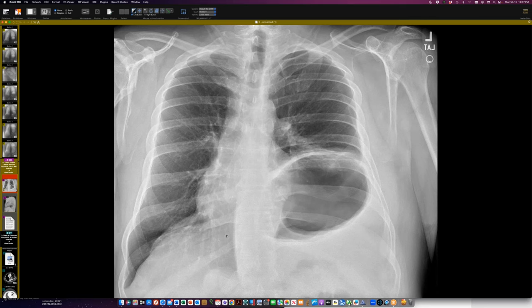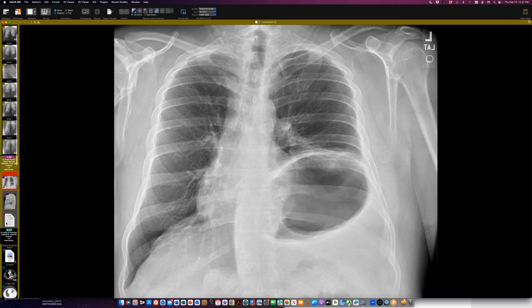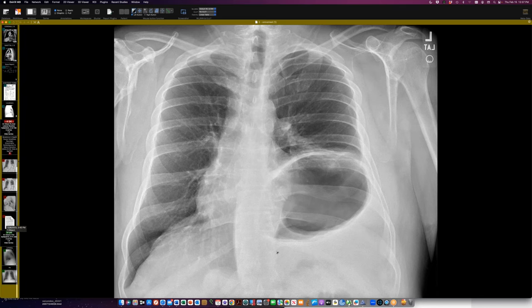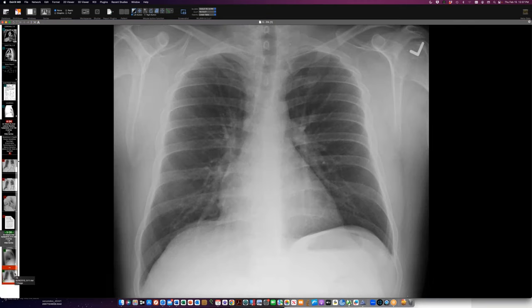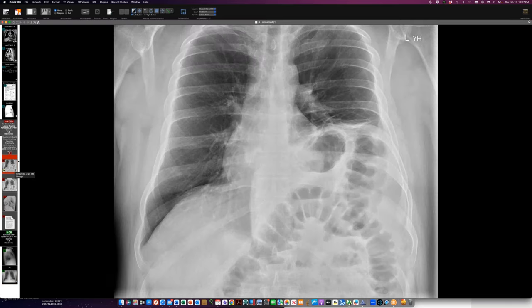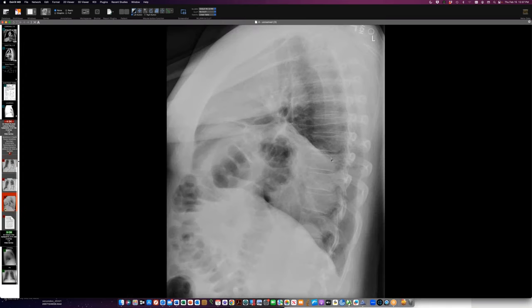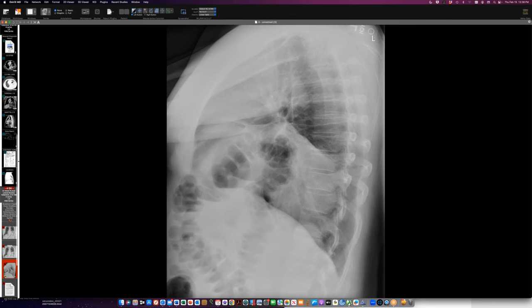A number of patients I've seen for diaphragm fluoroscopy have spontaneously told me this, and I now ask them if they get shorter of breath bending over to tie their shoes from a sitting position. This person developed elevation of the left hemidiaphragm in December, still there in January. An old radiograph from 2010 shows the left hemidiaphragm in normal position. Since mid-December it's been elevated all the way to the back chest wall, suggesting paralysis rather than eventration — eventration usually gets back to normal height posteriorly.